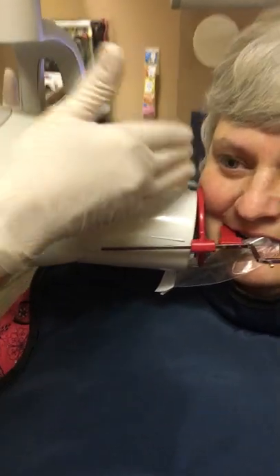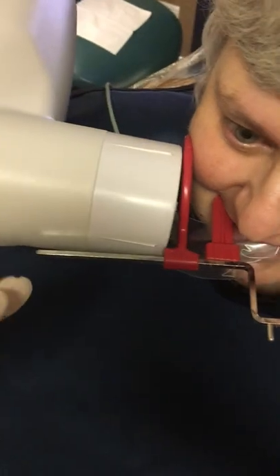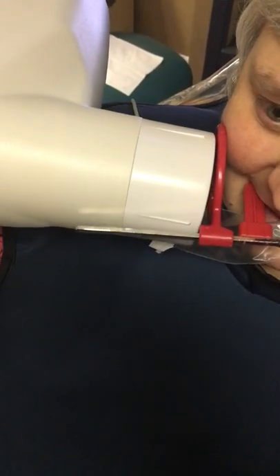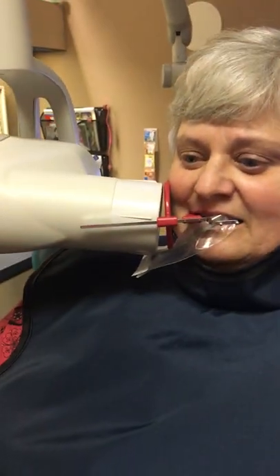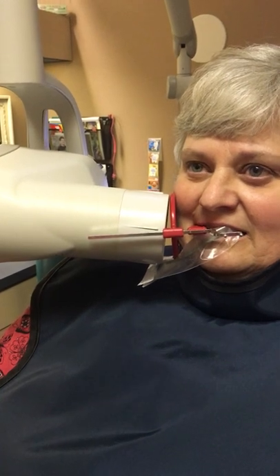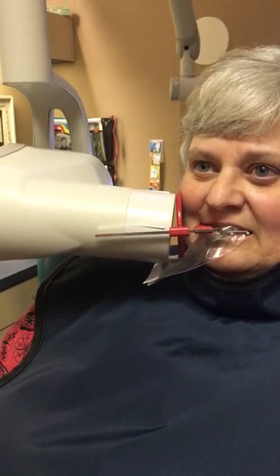I come up a little bit further on the front of it. Right now I'm using the target — when you use the target, sometimes it's harder to get all the contacts open — but I'm doing it this way just so you'll be able to see how it works with the target.